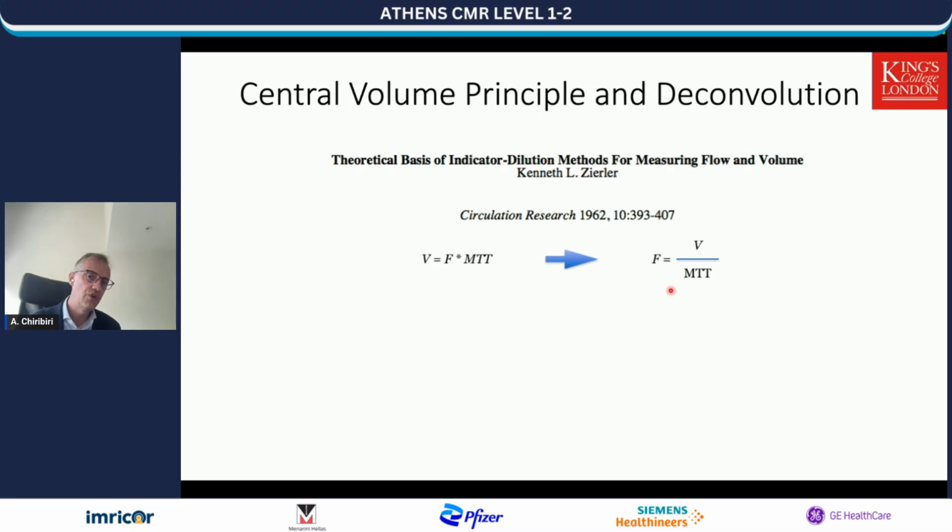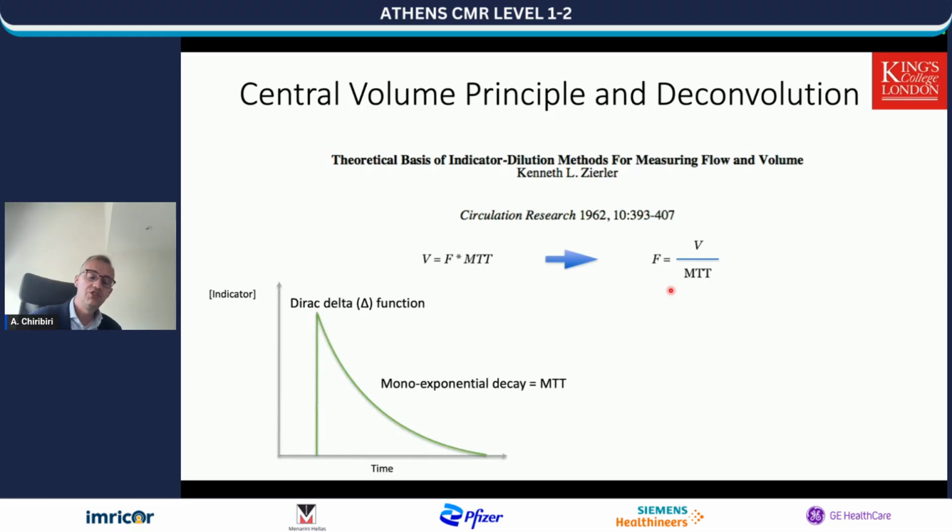So effectively, we are focusing on the washout phase. And this can be nicely visualized by the first mathematical representations of this phenomenon, which were actually just on a theoretical basis.